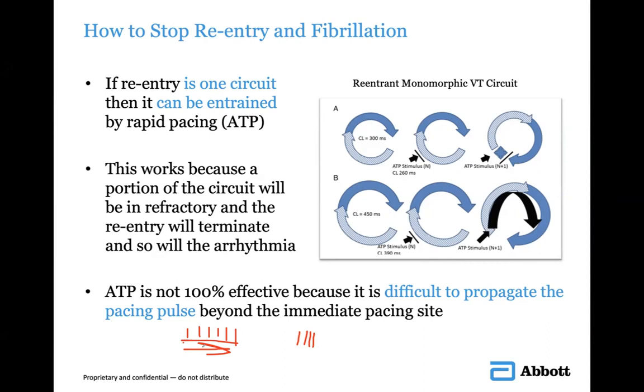Dr. Amitesh, can you explain this wearable cardioverter defibrillator? Which one? I didn't get your question. Wearable cardioverter. A wearable. Like a Zoll.